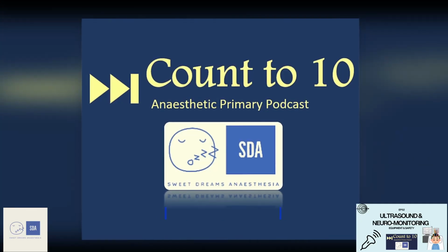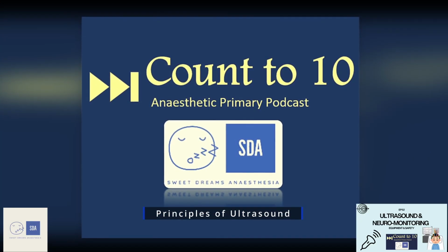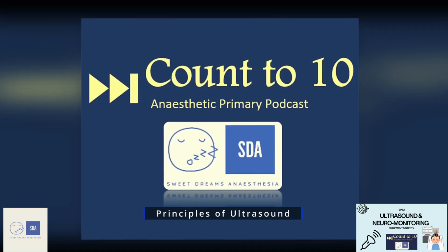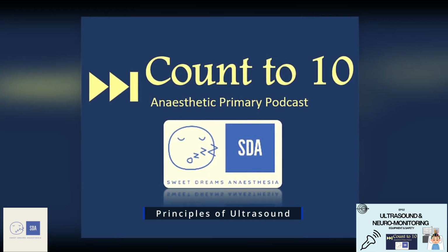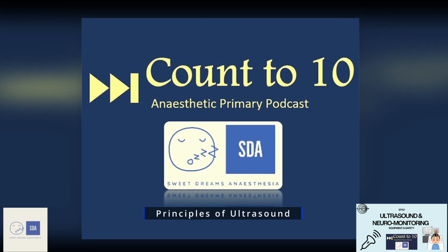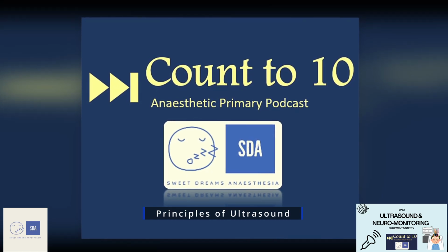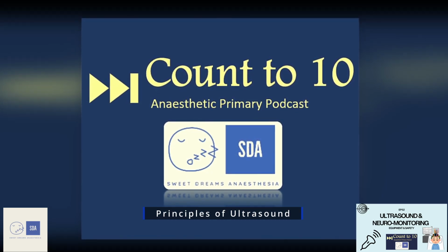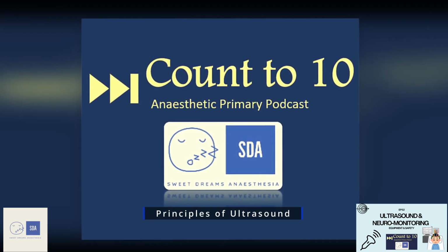The first learning objective today is describe the principles of ultrasound imaging. An ultrasound is a device which produces sound waves that are high frequency, greater than 20 kHz, which are inaudible to the normal hearing range. With medical ultrasounds, the frequencies produced are extremely high, typically 1 MHz all the way up to now 15 MHz on the new ultrasound probes you might see around your hospital.